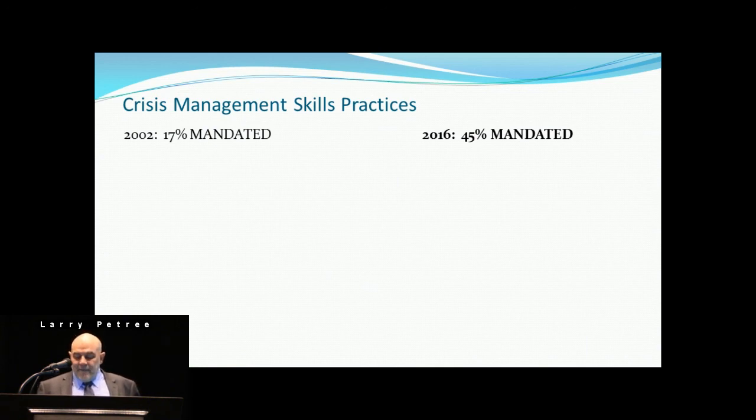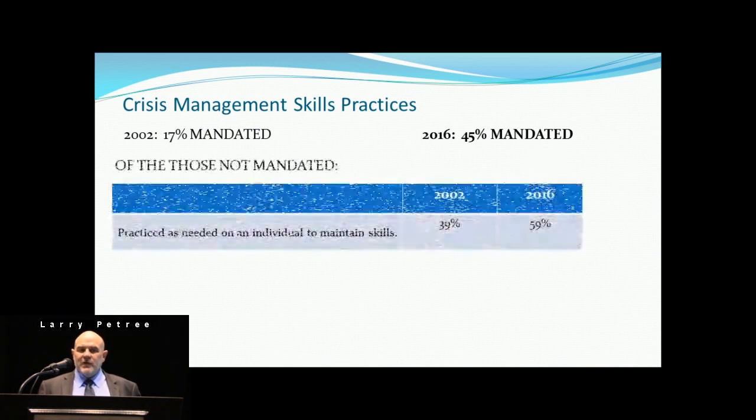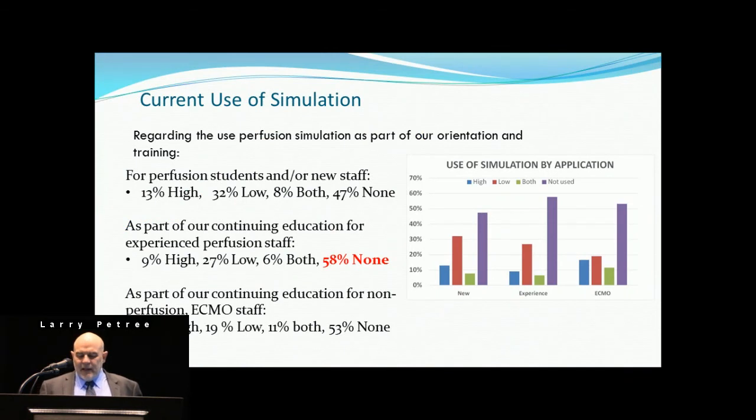Now 59% think that they need to practice on their own, which is a little disturbing too. I'm not sure how we get to that. If we go back and look at this earlier slide, we'd seen that 58% of practicing perfusionists don't use simulation to practice. So we've got a little bit of a gap developing here in how do we maintain skills and proficiency.